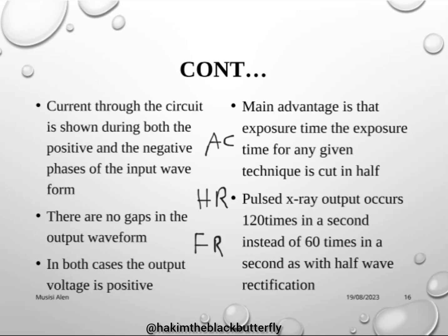So in this case, there are no gaps in the output waveform. In both cases, the output voltage is positive. The main advantage is that the exposure time for any given technique is cut in half.